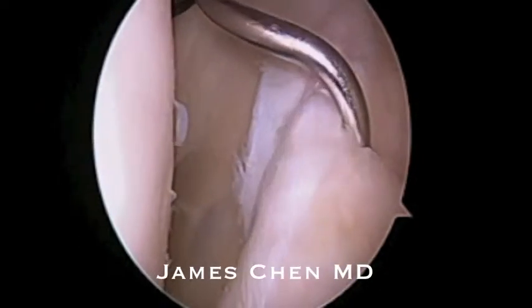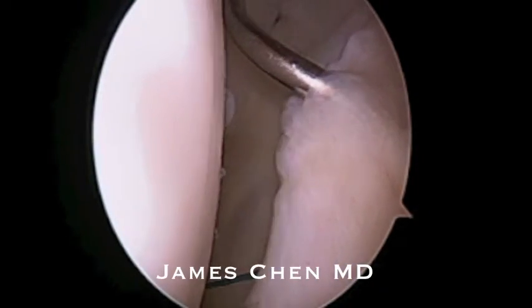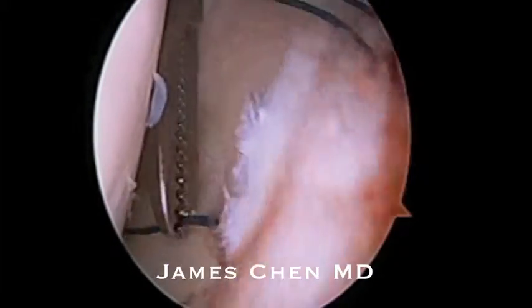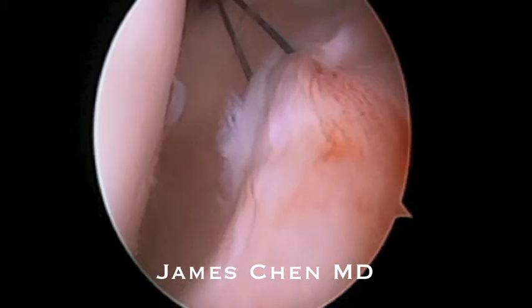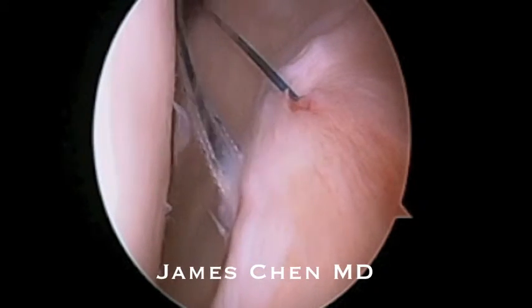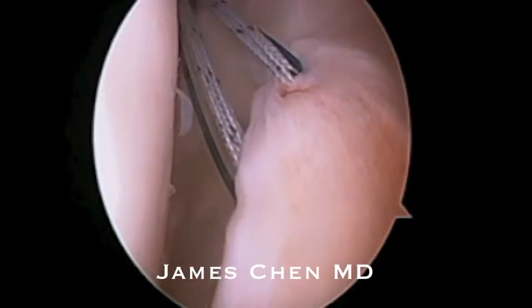I am now passing a shuttling suture through the posterior superior labrum. I am retrieving the suture through the anterior portal. I am then shuttling a suture that I will cinch down.